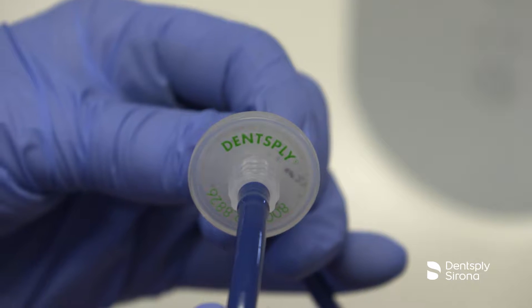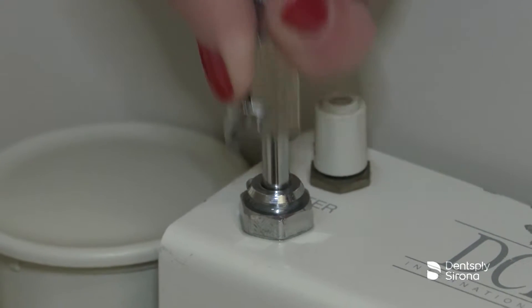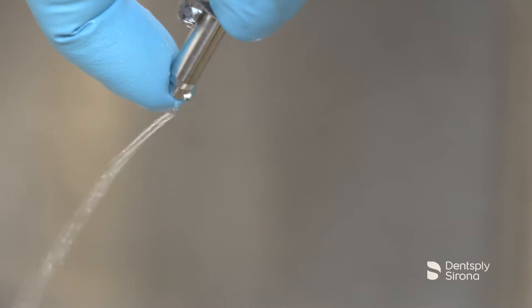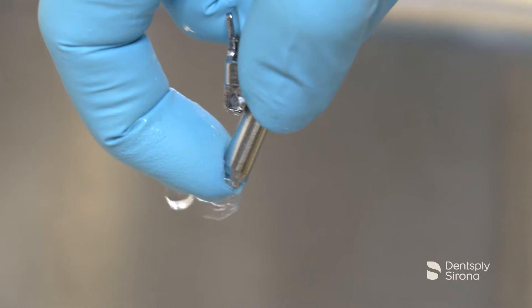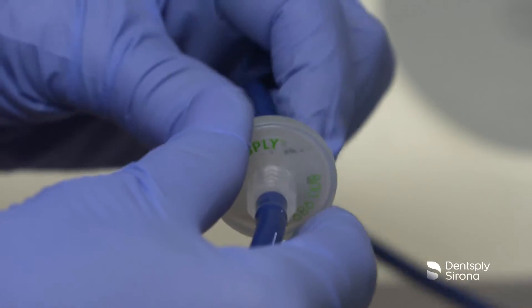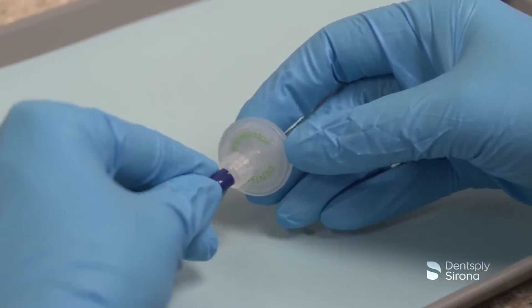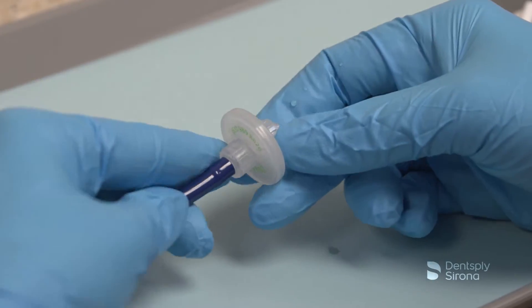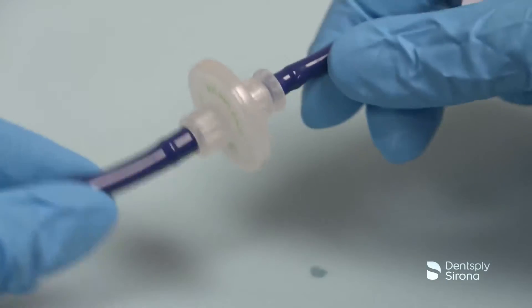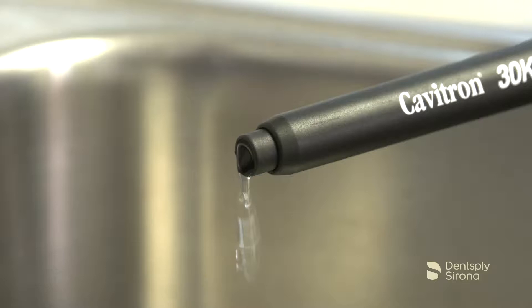To change the water filter, begin by verifying that the system is turned off. Disconnect the water supply hose from the dental office water supply. If a quick disconnect connector is attached to the end of the hose, relieve the water pressure by pressing the tip of the connector in an appropriate container and drain the water. Grasp the fittings on either side of the filter disc and twist counter-clockwise. Remove the filter section from either side of the water hose. Install the replacement filter onto the water hose fittings, positioned to match up with the correct hose fitting. Hand tighten one hose fitting onto the filter in a clockwise direction, then tighten the second hose fitting in a clockwise direction. Reconnect the water supply line and operate the unit to bleed the air and test for any leaks.